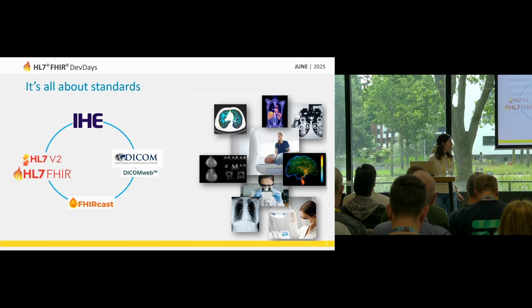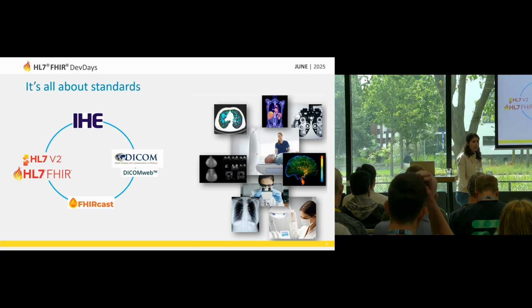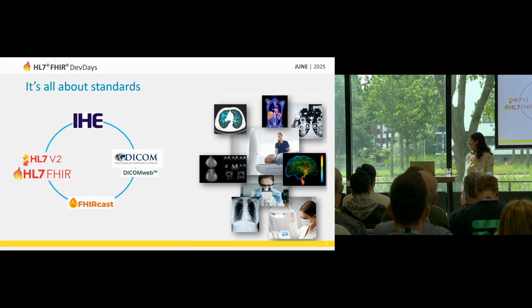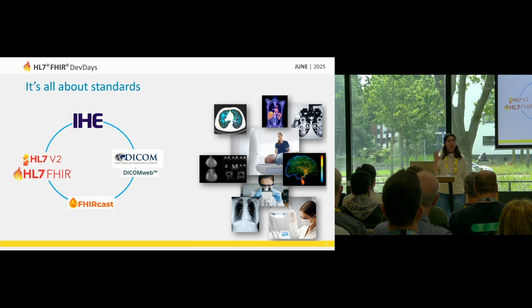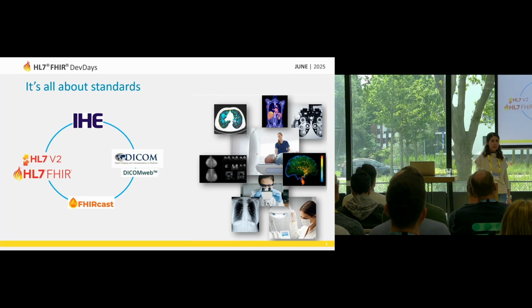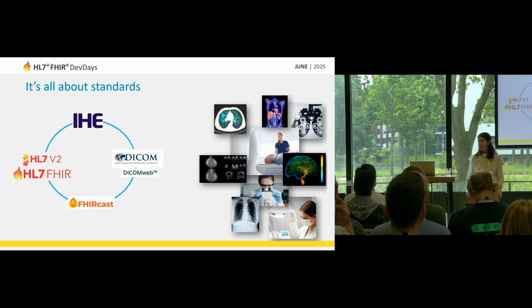But of course, we need to think in a standard way, so it is not just all about DICOM. We have had, since years ago, HL7 version 2 messages for the patient demographics. And we have IHE, which defines the workflow and how these standards shall play along. Some years back, FHIRcast was introduced, so that you are able to share the patient context when you are doing the diagnostic reports, and recently you are also able to share content, like findings and measurements, using FHIRcast.